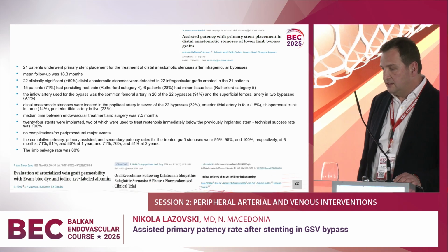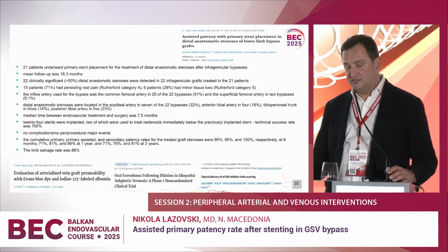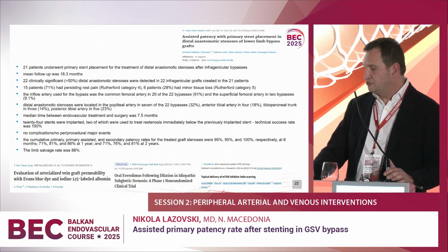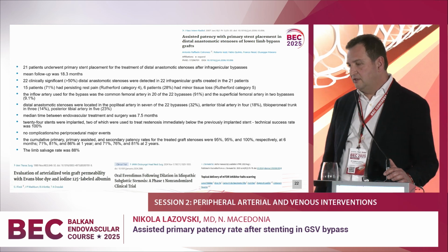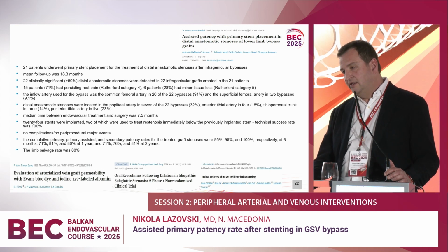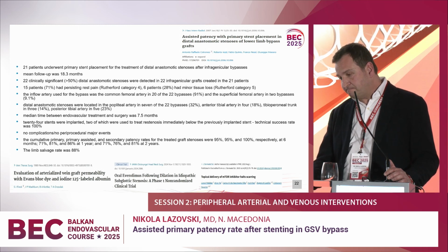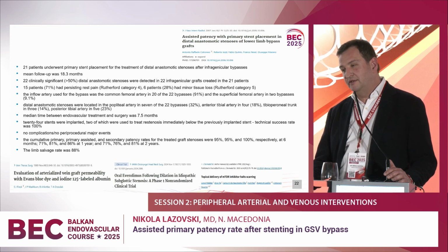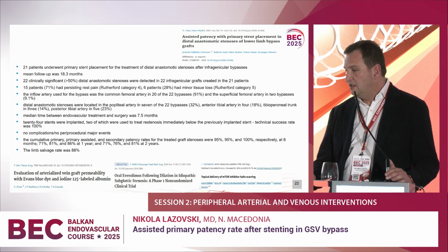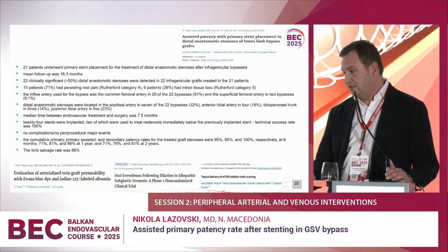There are several studies that show us that rapamycin is very well known for stopping scar tissue and its ingrowth. In another study, a small study on dogs, we found that arterialization of the vein 6 months after implantation is much more permeable than the initial phase of the implantation.